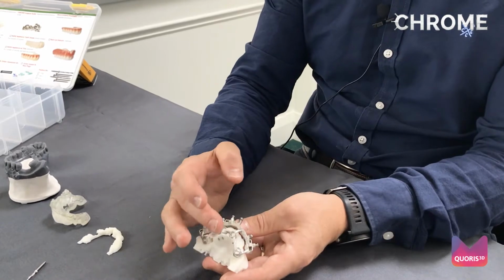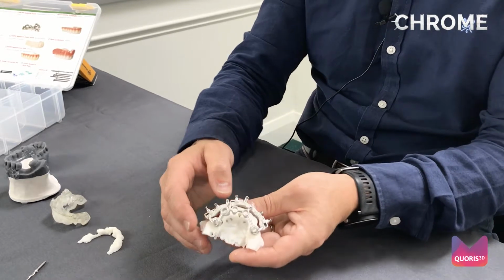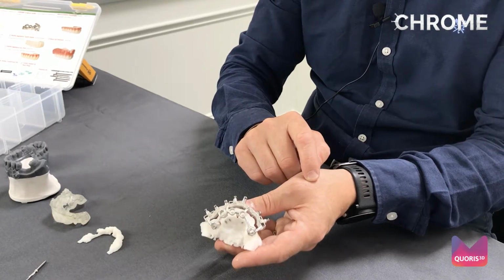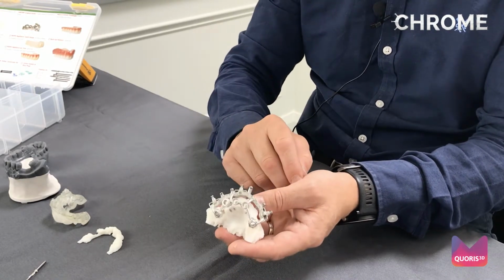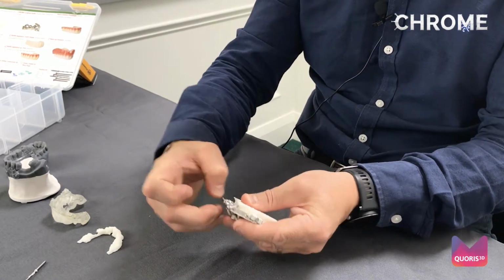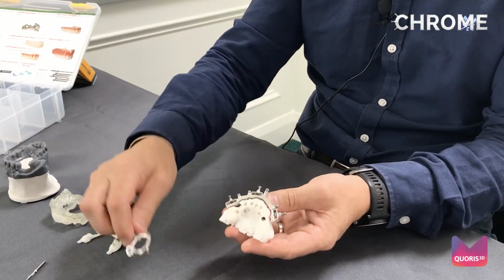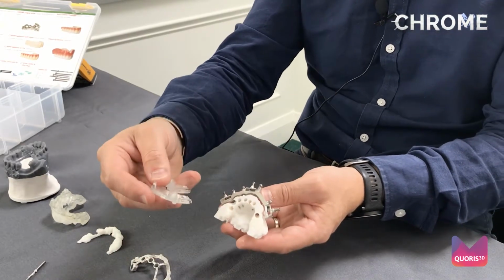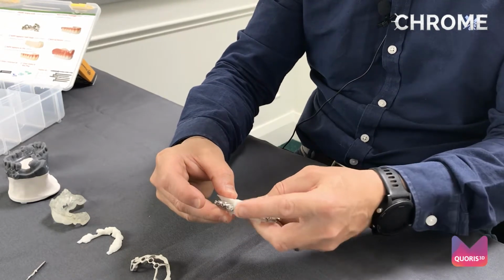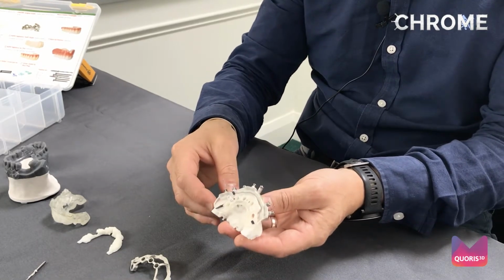Using your guided kit, you then place your implants, and as we've said, there's 3 hexagonal attachments on this, which shows that those are angled MUAs, and 2 round, which show that they are straight. Once the implants have been placed and everything has been secure and you're happy, you then simply just undo the Swiss lock, remove your osteotomy guide, and then place your transfer plate for the restorative stage. Again, it clicks in to the Swiss locks, okay, and you then go ahead and place your abutments.